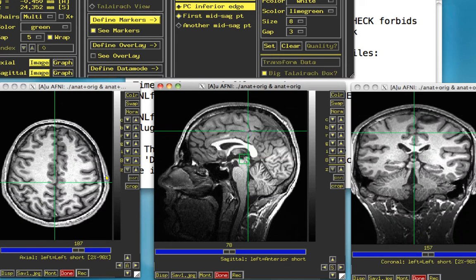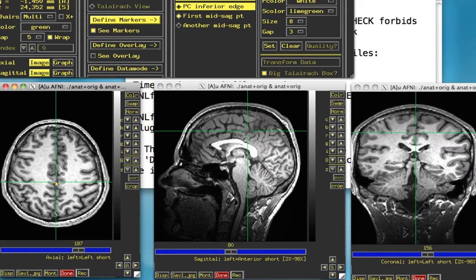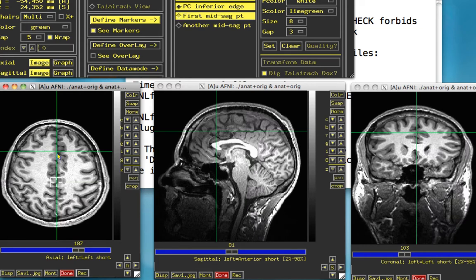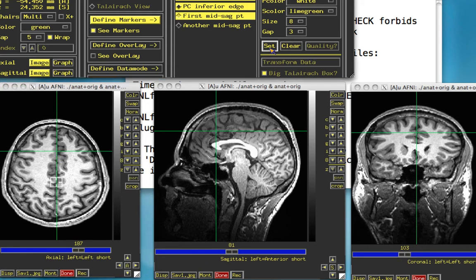The mid-sagittal points are in the cerebrum, and we want them right between the two hemispheres. I usually choose one that's right behind the posterior commissure, about right there — that's our first mid-sagittal point. The second mid-sagittal point needs to be at least two centimeters away from the first. For this one, I usually go a little bit more anterior, maybe just anterior of the anterior commissure. Make sure you're between the two hemispheres, about right there, and click Set.